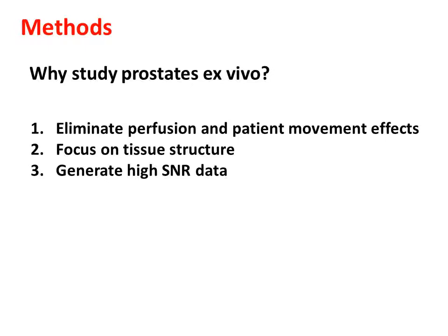Now, there's possible changes in tissue structure because of that lack of perfusion, but our argument is that if we can't see significant diffusion differences under these ideal ex vivo conditions, then there's probably no point in chasing them in vivo. And the other nice thing about the ex vivo scans, apart from being relatively cheap to perform, is that we get very good quality data with very high SNR.